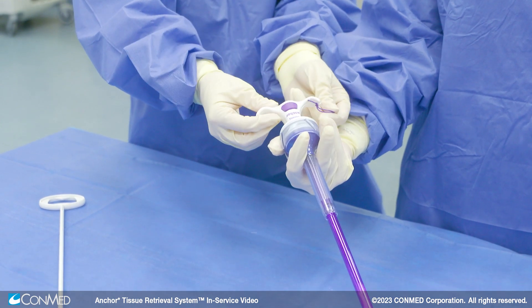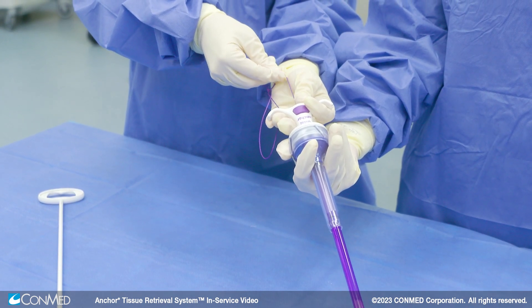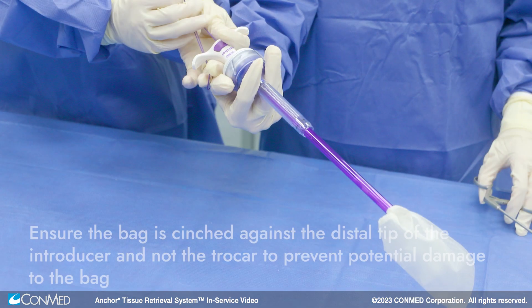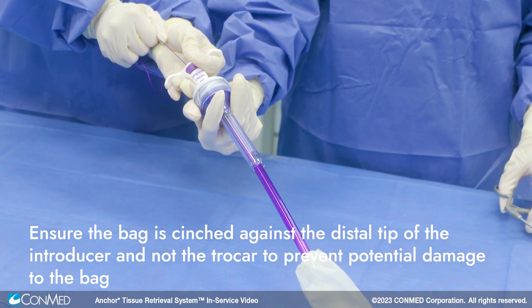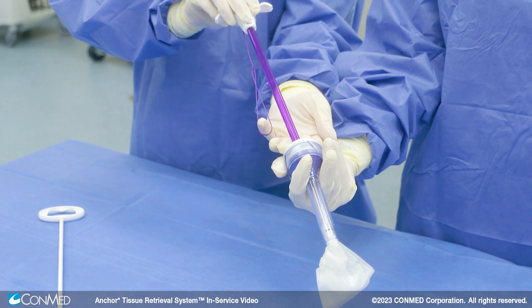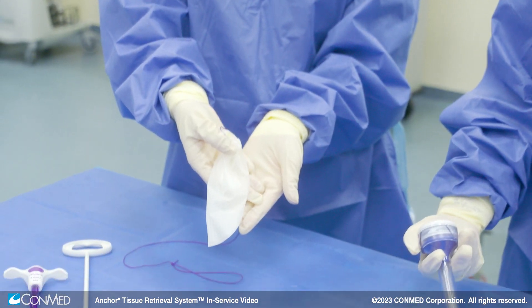Once the plunger has been removed and inspected, release the string from the handle notch and pull tight to cinch the bag against the introducer. The loop in the string can be used for added grip. Ensure the bag is cinched against the distal tip of the introducer and not the trocar to prevent potential damage to the bag. Finally, remove the introducer tube from the trocar or cannula. Remove the specimen and bag from the body cavity and dispose of per facility protocol.